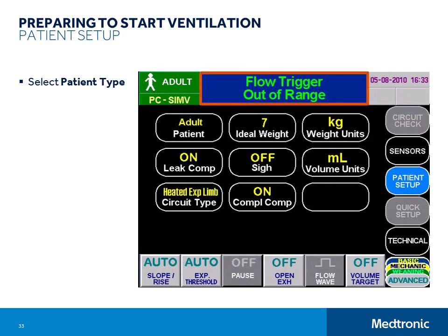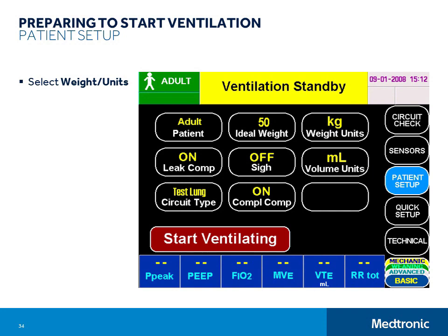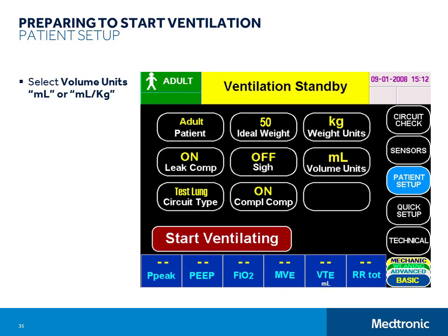The next step is to select Weight Units and Weight. If you intend to use the Quick Setup function for determining start-up ventilation and alarm settings, you will need to enter the patient's ideal body weight, which is calculated from their height and gender, and select the weight units in pounds or kilograms. If you do not intend to use the Quick Setup function, you can skip this step. If you have entered an ideal body weight, you can also choose to display exhaled tidal volume numeric displays in mL/kg instead of mL. Next, set the Sigh function on or off. The Sigh function gives a sigh breath every 100 mandatory volume control breaths. The sigh tidal volume is 1.5 times the set tidal volume.